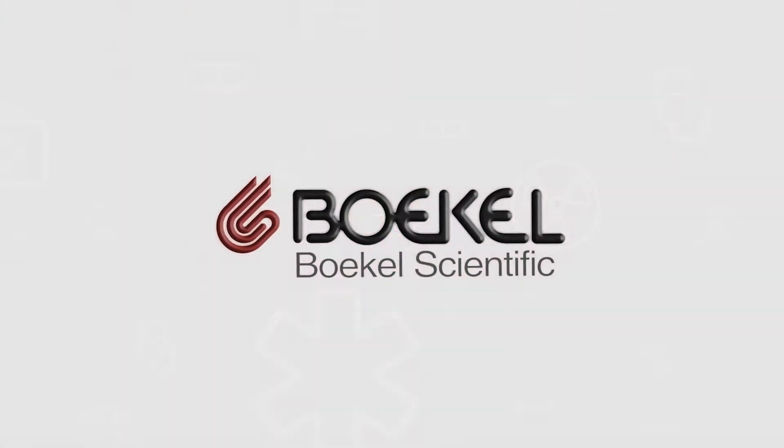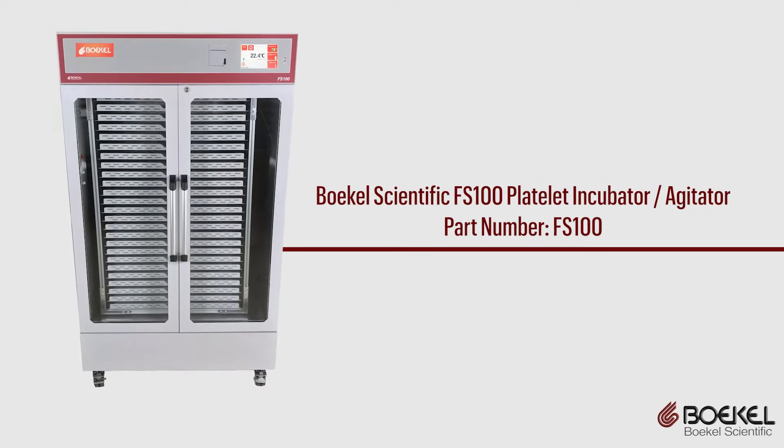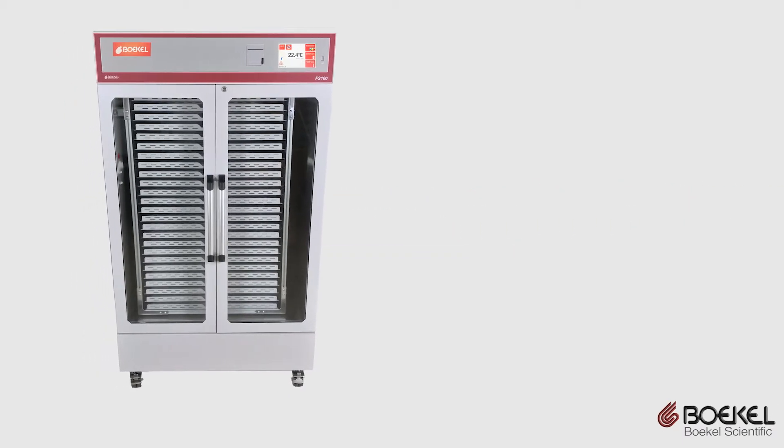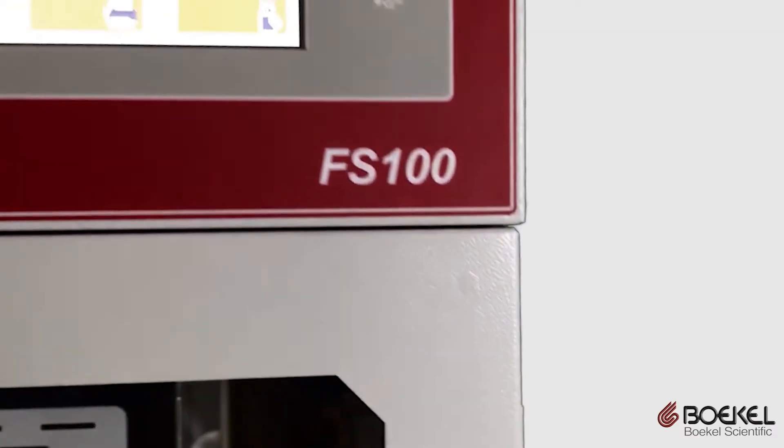Introducing the Bocal Scientific Floor Standing Platelet Incubator Agitator. Bocal Scientific, a leading U.S.-based manufacturer of blood banking equipment, presents the FS100.